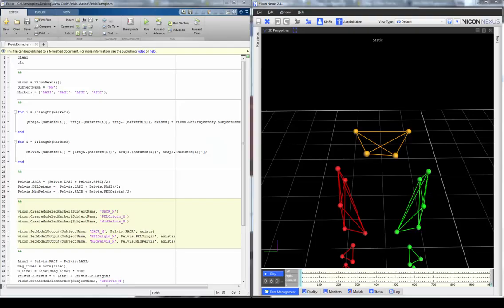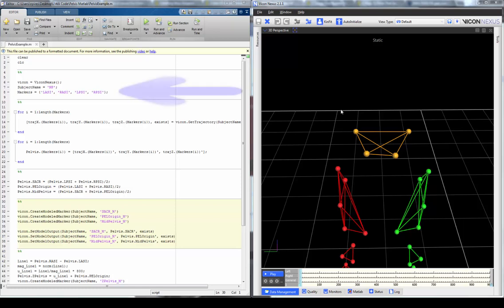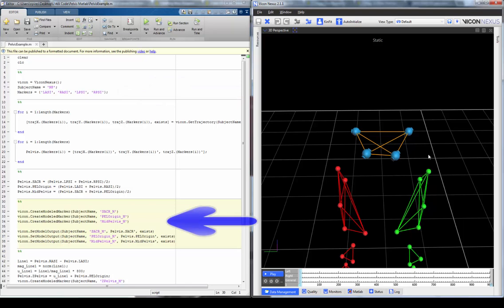Nexus 2 allows direct interface with MATLAB, enabling the user to directly edit the C3D file within Nexus as opposed to exporting data to an external source. A few things we can do include filtering both trajectory and analog data in MATLAB, setting gait cycle events, and doing biomechanical modelling directly through the Nexus 2 MATLAB interface. I'm going to show you a simple example script that uses the trajectories of the four pelvis markers to create the sacrum, mid pelvis, and pelvis origin modeled markers, as well as a coordinate system at the pelvis origin, and output these directly to the C3D file.